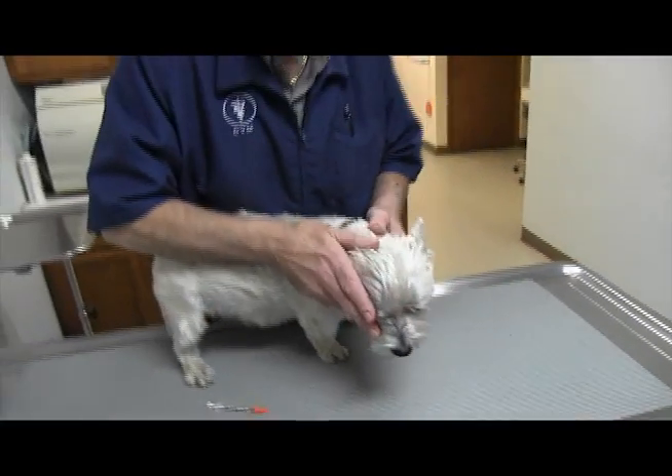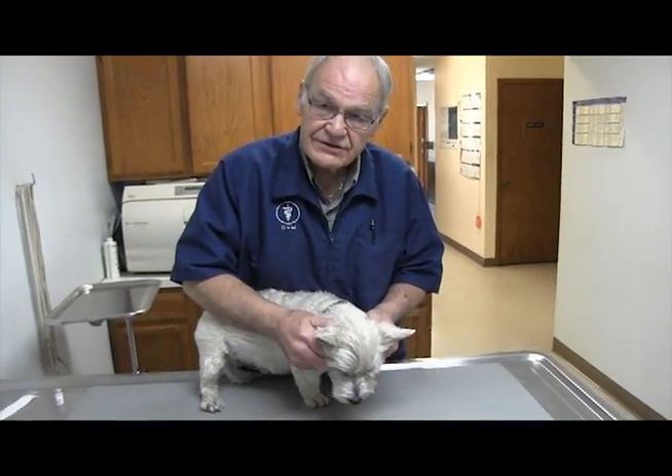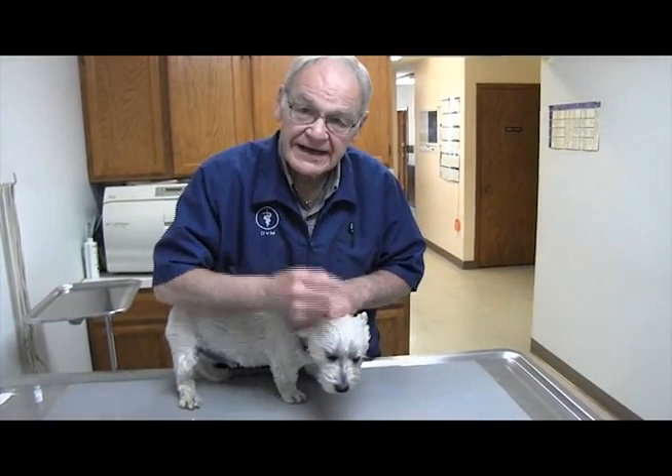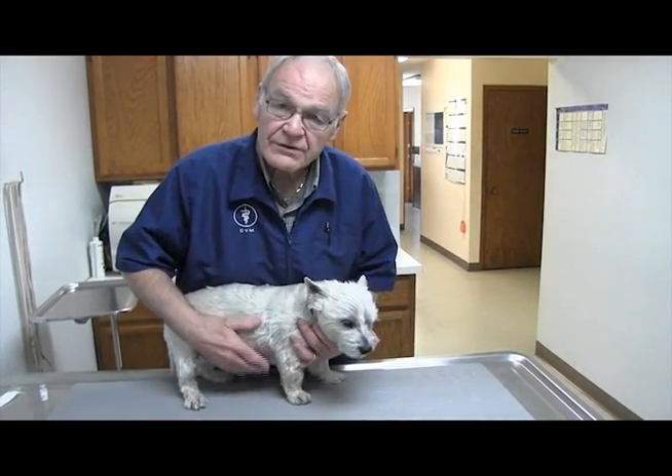But as I say, most clients don't test their dog's sugars themselves — they leave it to those of us who know how to hit veins and so on in order to do it.